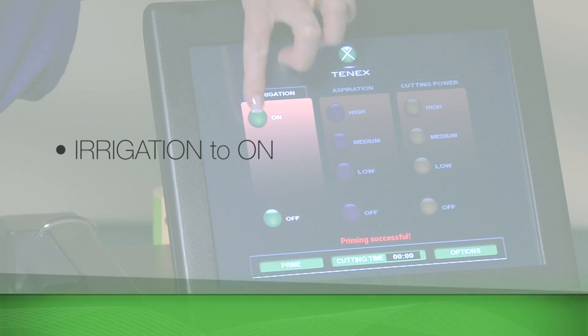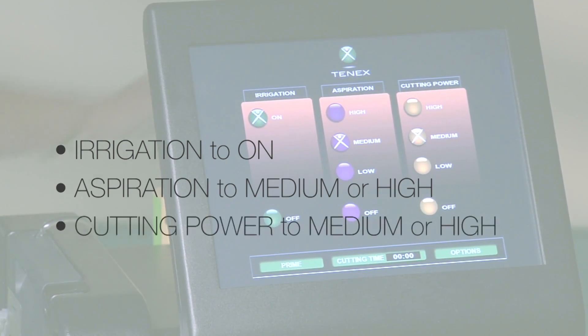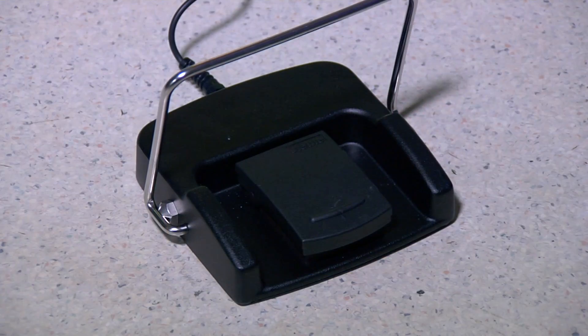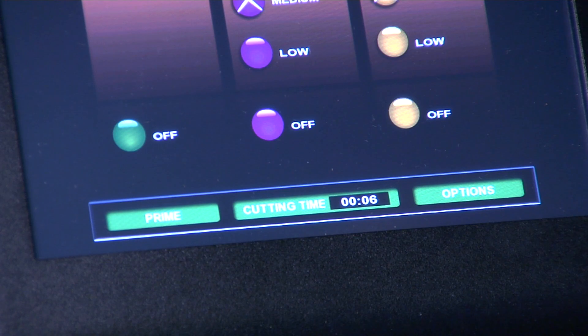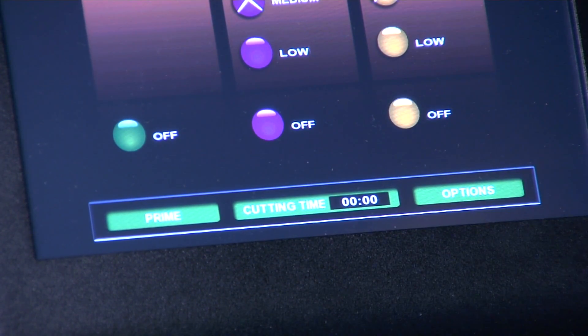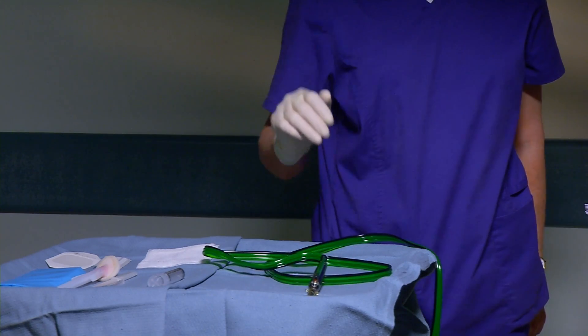Select irrigation to on, aspiration to medium or high, and cutting power to medium or high. Depress the foot pedal for a few seconds to test for the acoustic signal. Reset the cutting time clock by pressing the cutting time key. Place the handpiece back on the sterile field until ready for use.